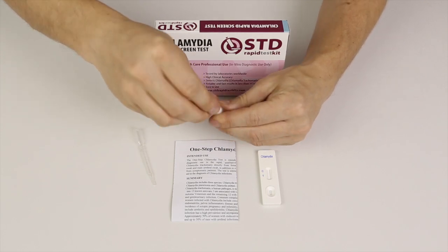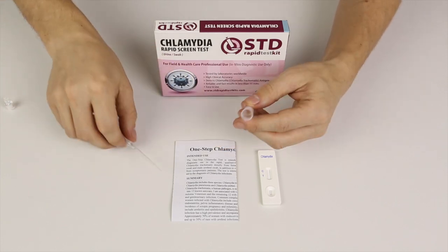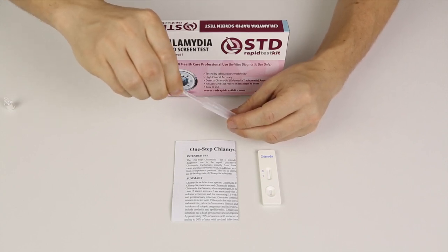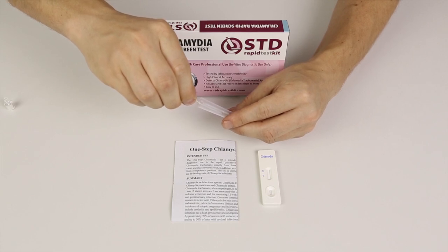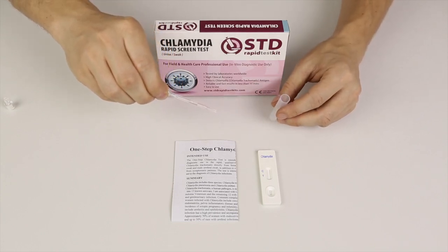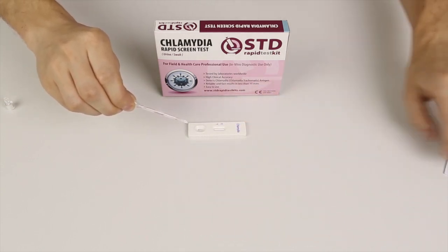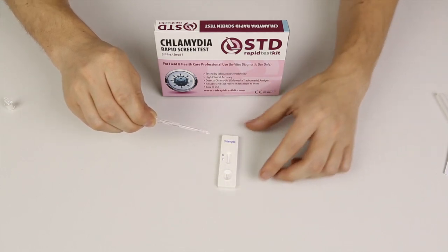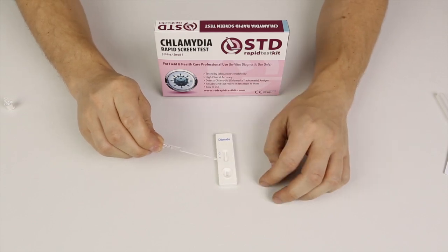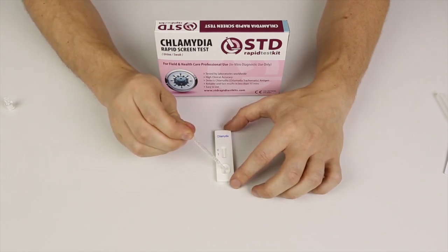I'm done with the swab and I'll just dispose of that. I'll put the cap back on the extraction tube and shake it for a little while. Now I'll use the micro pipette or dropper — what you need is four drops out of this, and with four drops that is all we need. I've got four drops now. I'll put the cap back on and dispose of the mixing tube. Four drops is all we need — I'll insert that into the sample well: one, two, three, four.